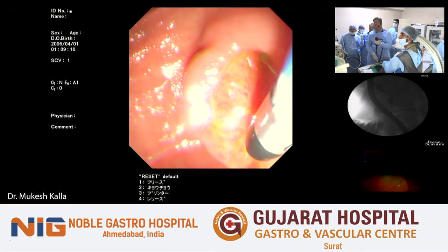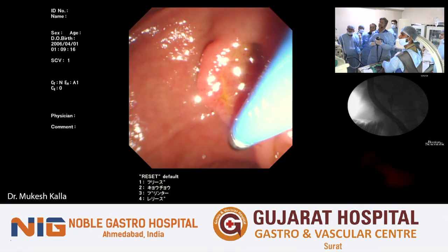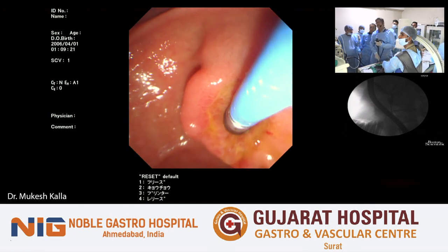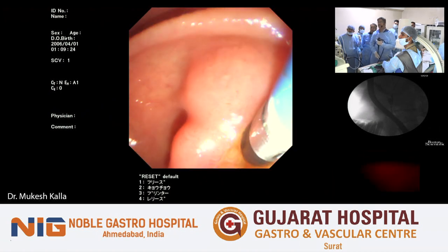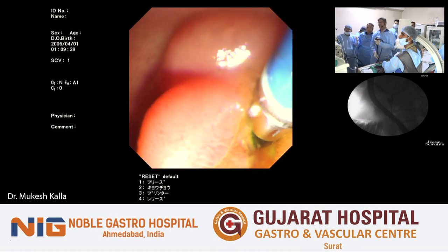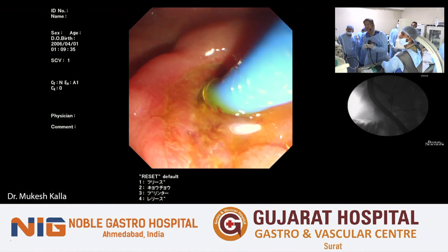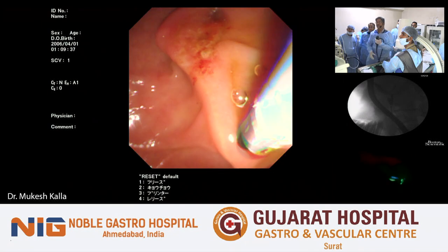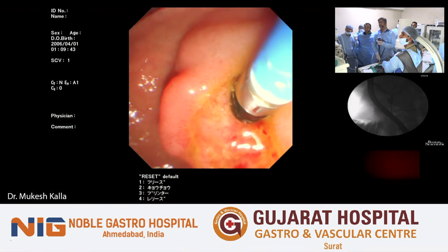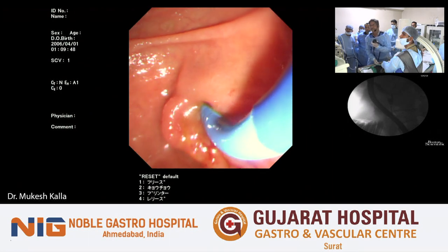So the best thing is that the light blue, the sky blue thing, should be dealt with as little as possible if you want to preserve the scope. So that is what I was trying to tell you. If you have a sphincteroplasty, the insertion is easy, but if you don't have the sphincteroplasty, then intermittently you will have to use the elevator to push the cholangioscope inside. Few people also place a guide wire inside the common bile duct, and over the wire they push the cholangioscope, which can also be done.